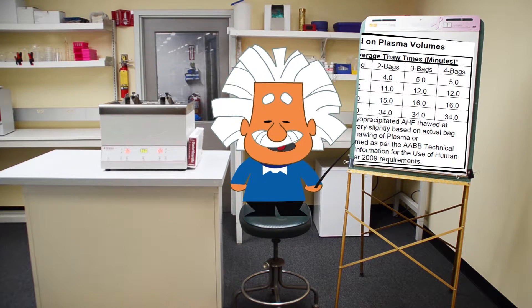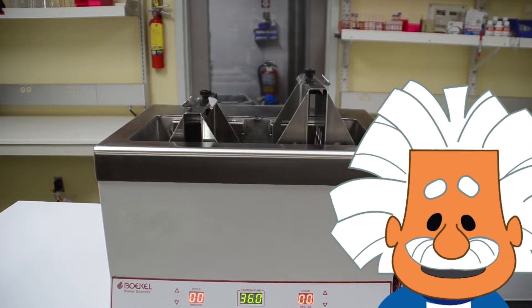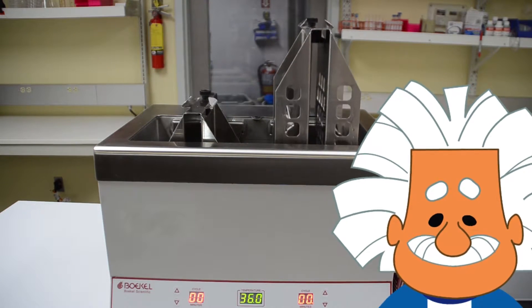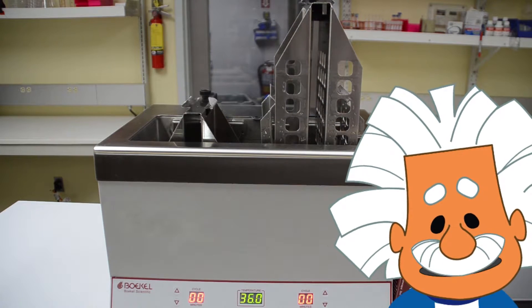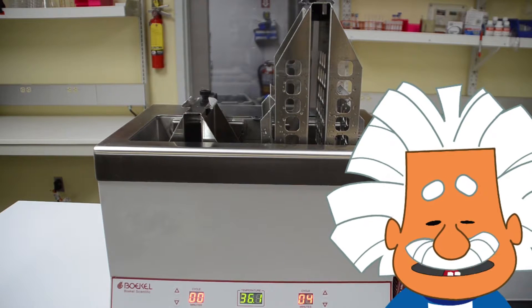Now let's run the unit through a cycle. For one 250-milliliter bag of frozen plasma, we need to set the timer to 11 minutes.